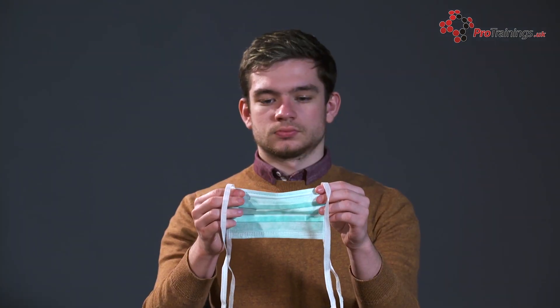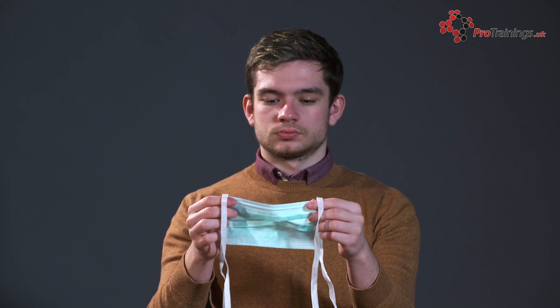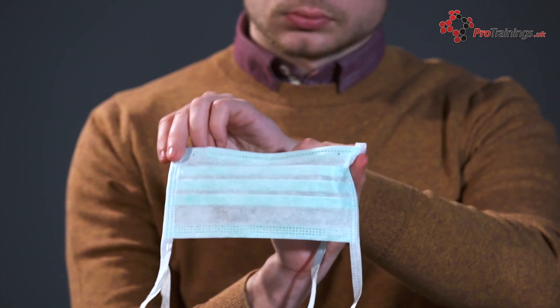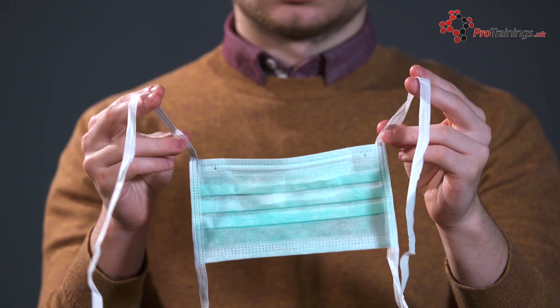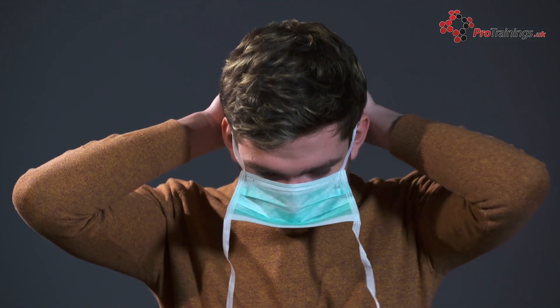Check the mask and work out which is the top, which is where the foldable nose clip is, and see which is inside and out. Most masks are white on the side that you place against your face and coloured, often blue, on the side that faces outwards. There are different types of straps to hold them in place — tie back or elastic straps that either go over the ears or behind the head.